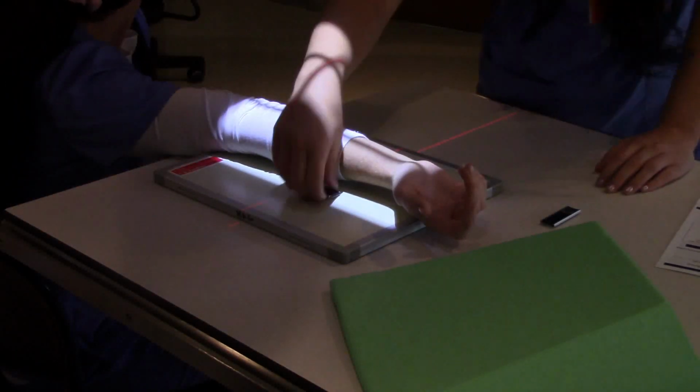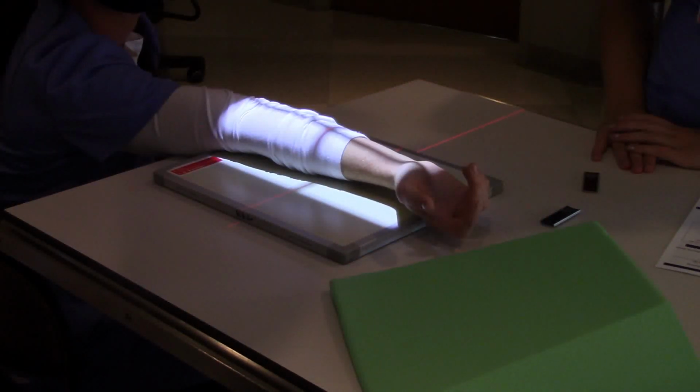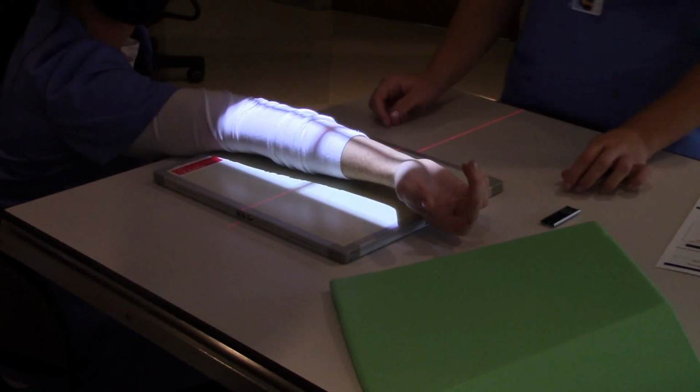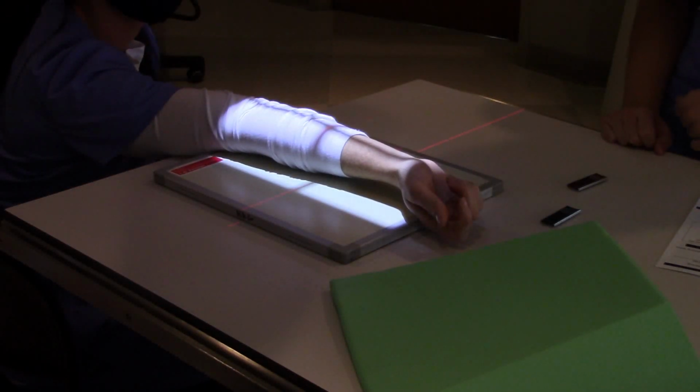Nice. Okay. And now, what if we take this image and we've clipped off the elbow joint? Oops. Well, do we redo the whole thing, or can we just do a supplemental AP elbow, right? Yeah, should you just move it down and collimate it? Uh-huh. Okay. Exactly. Now lateral.